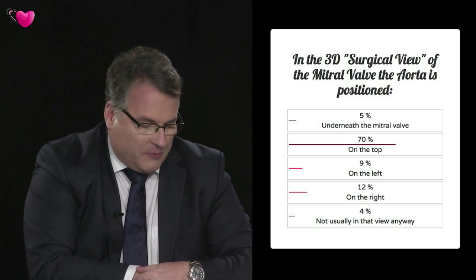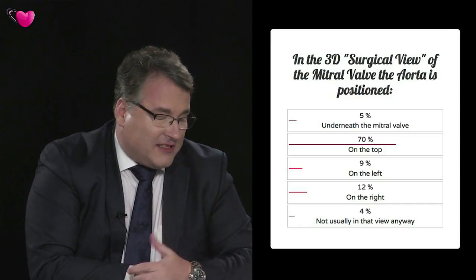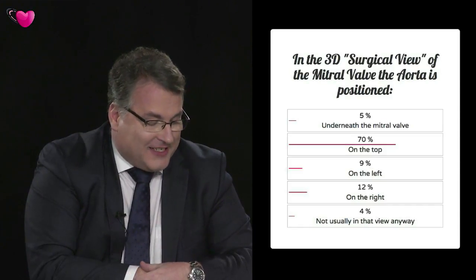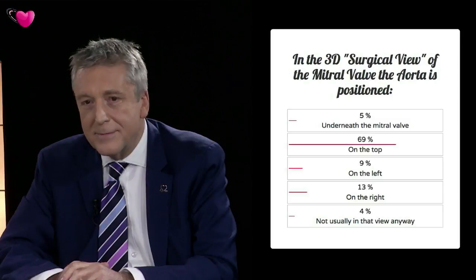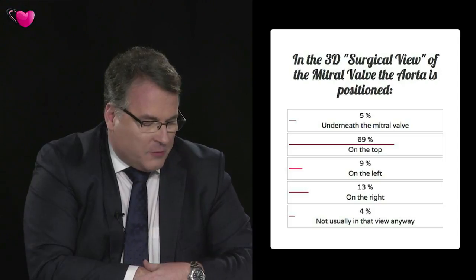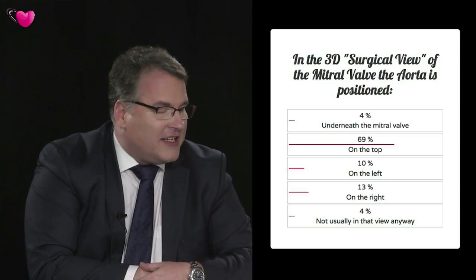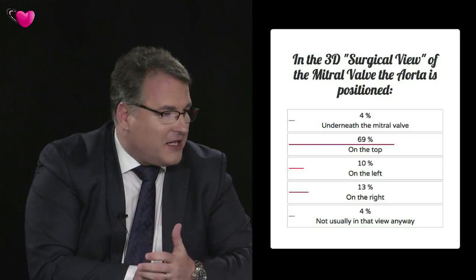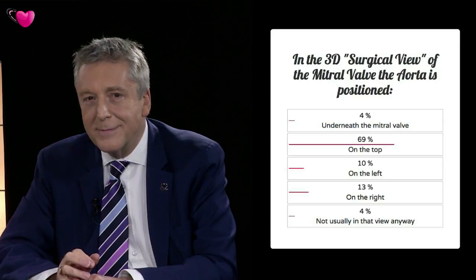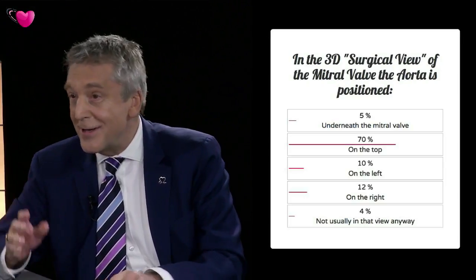So 5% were answering that it's underneath the mitral valve. 70%, and I think that's already the majority, says it's on top at 12 o'clock, which is true. A very good audience. 9% were stating it on the left, 13% on the right, and 4% said it's not usually in that view anyhow, but I think 12 o'clock is a pretty good bet. We're 70% of our viewers. Good.